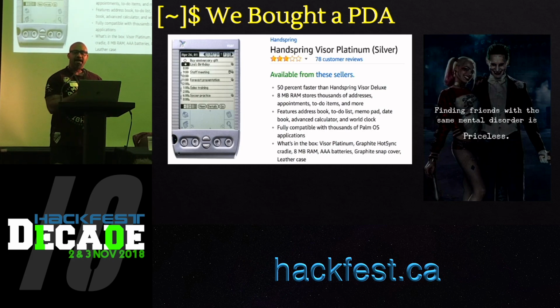Once we had the PDA connected to the infusion pump, we tried to export the wireless configuration settings onto the PDA. We were super pumped at this time, and we got it exported. Now we opened this application on our PDA to bring up the template that was exported, and it was blank. The template we got on the PDA didn't have any relevant information. It had some information, but no sensitive information like username and password. I guess someone on the manufacturer side figured that it's generally not a good idea to export sensitive information to a foreign device, which is good.